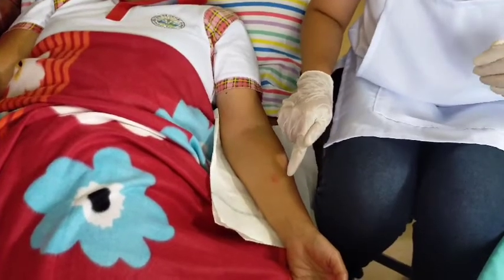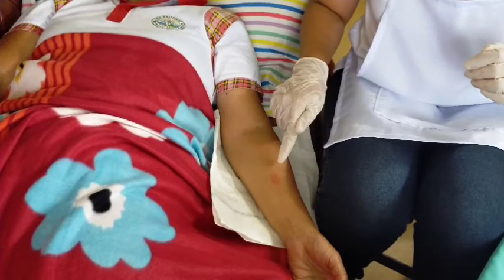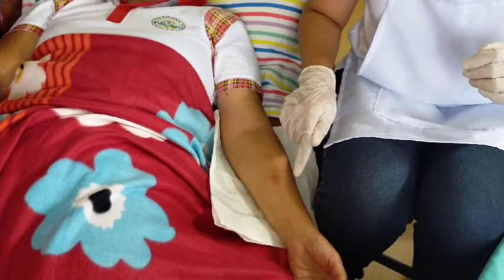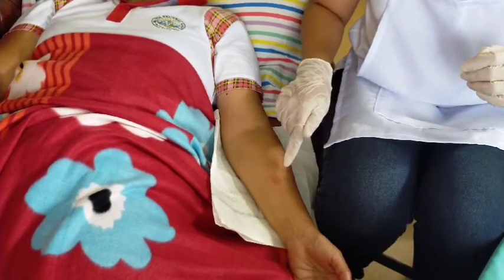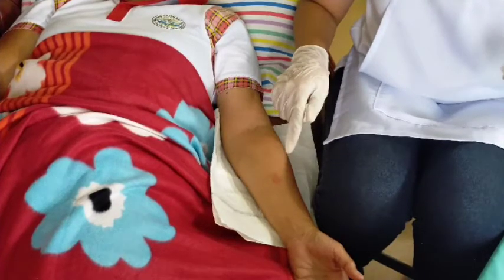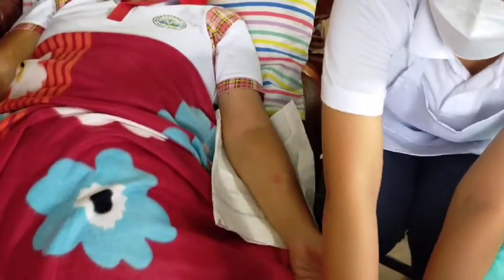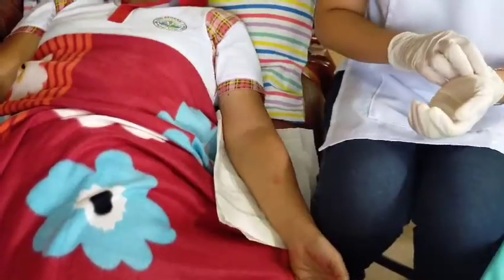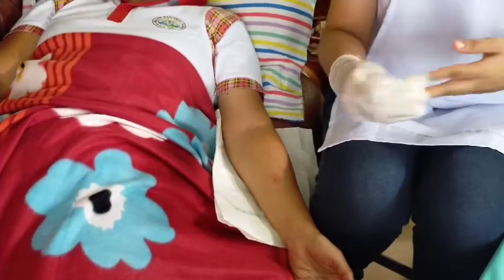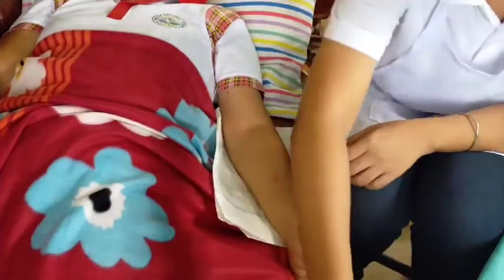After that, we're going to note the presence, amount, type, color, and odor of any drainage on the dressing. So, our patient's wound is 3 cm, serous type, pale yellow color, and no odor. Now, we're going to place the soiled dressing in the appropriate waste receptacle, and we're going to remove my gloves and dispose it in the waste receptacle.